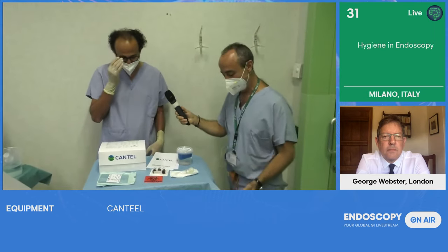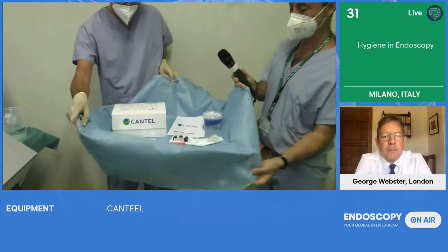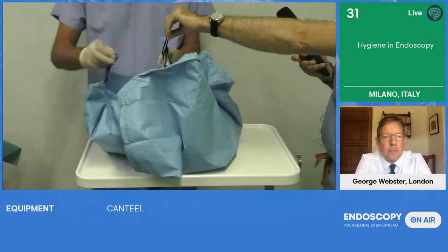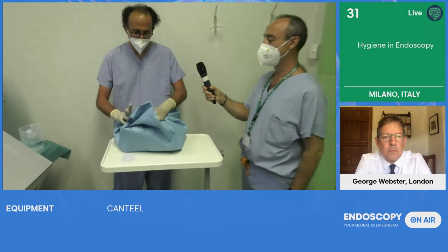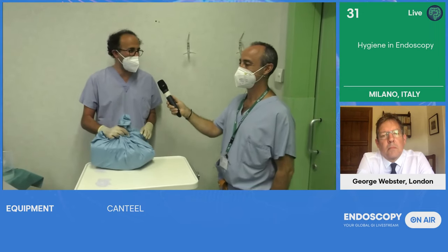Having said that, as an ESGE board member, can you show what we can do at the end? Yeah, we can keep everything clean. Exactly. We put the dirty scope here with all the consumables, and it is brought out of the room. No contamination at all. Absolutely. Everything is consumable and single use. So, Roberta, enjoy your case.